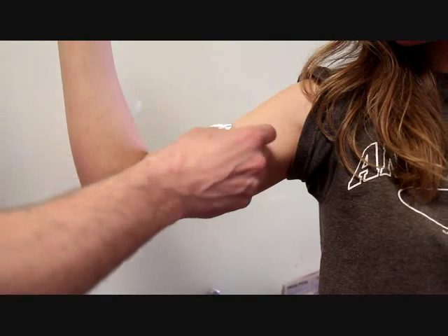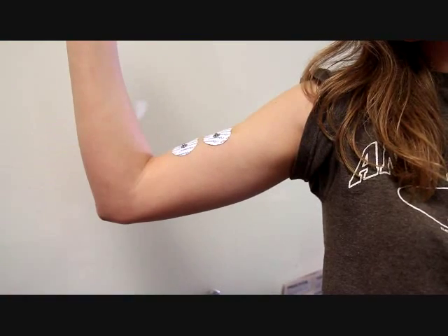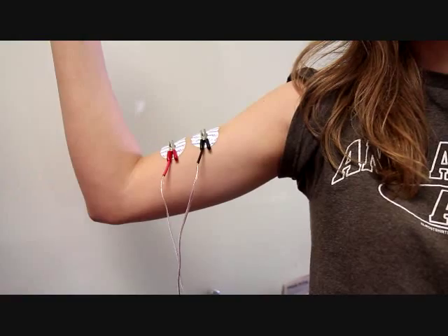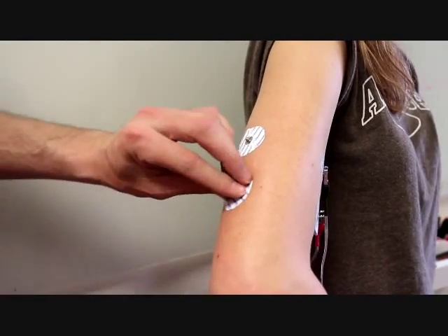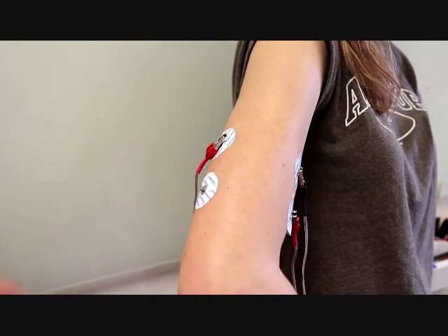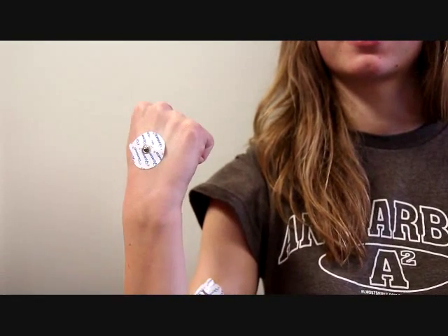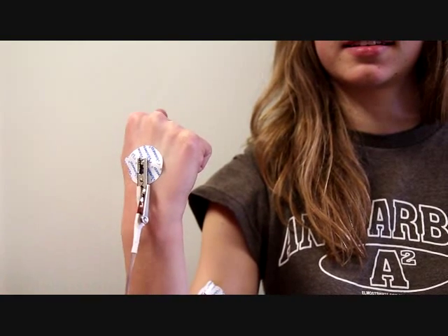Biceps and triceps located. To get started with our experiment, we'll begin by placing our sticker electrodes on the bicep and connecting the black and red cables from one channel. Then place the patch electrodes on the tricep and connect the black and red cables from the other channel. Then stick an electrode on the back of your hand and connect both of the white cables to this one.